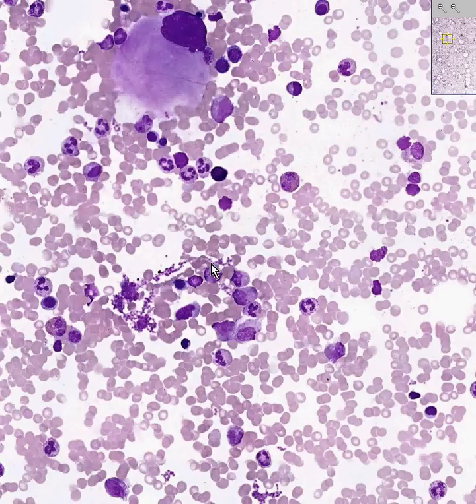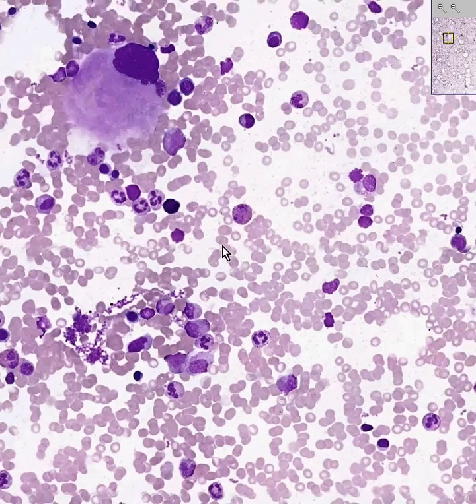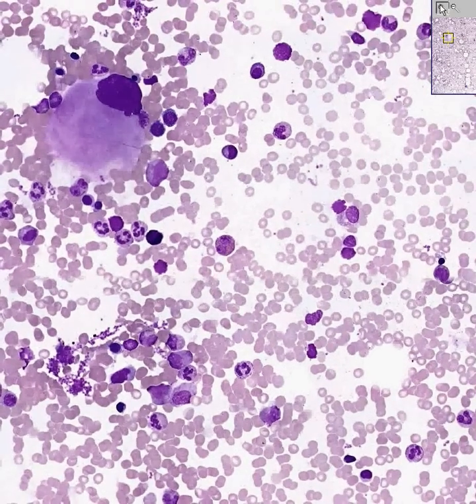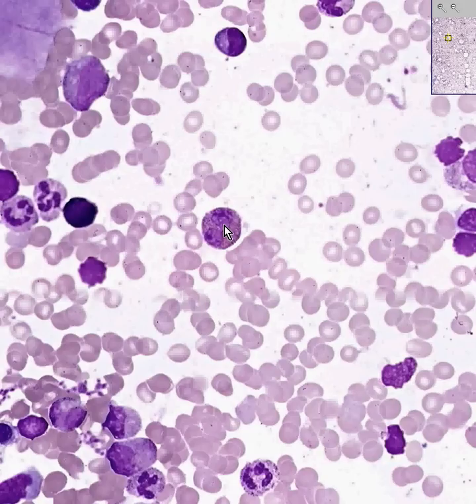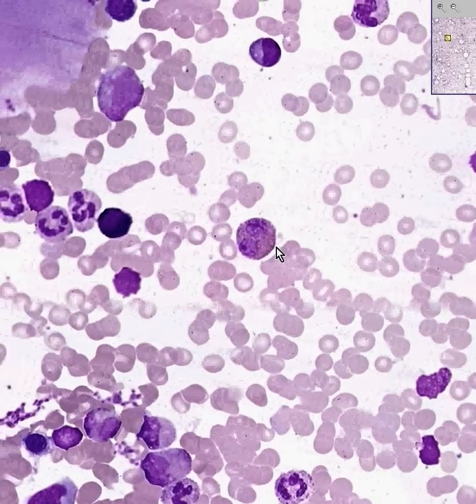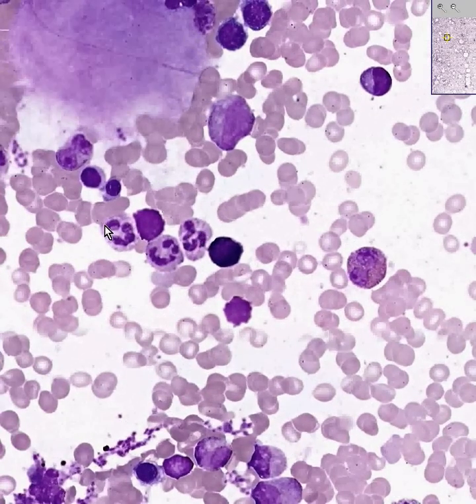Without going into all the details, let's just say that every one of these cells that have coarse granules in them will be in the white cell series and usually the granulocytic series. In addition, if we see that some of these granules look very red and have a bilobed nucleus, we know that this is either an eosinophil or something that will soon give rise to a mature eosinophil. The rest of these are granulocytes.